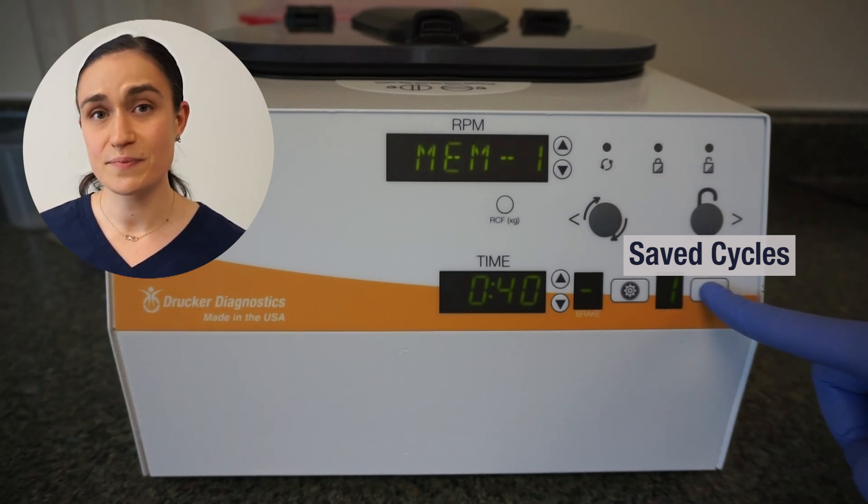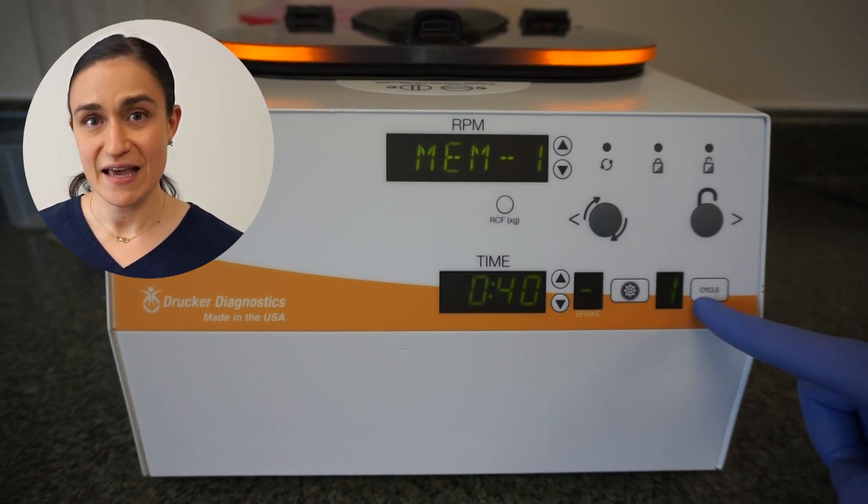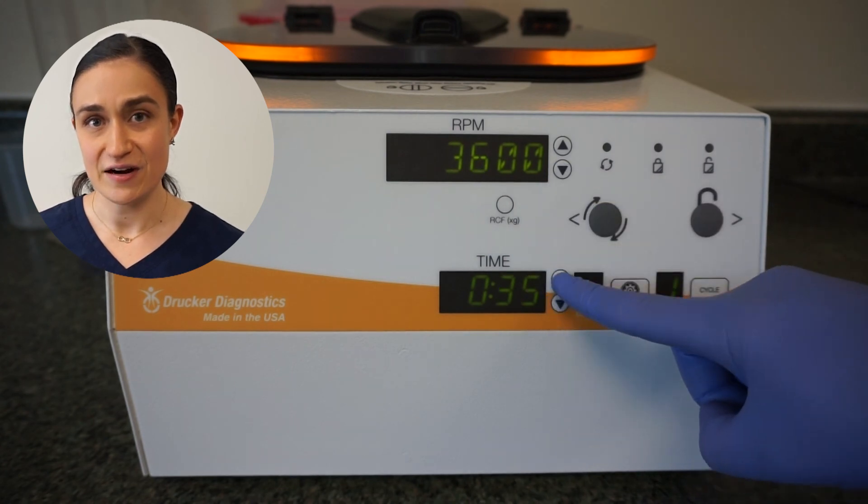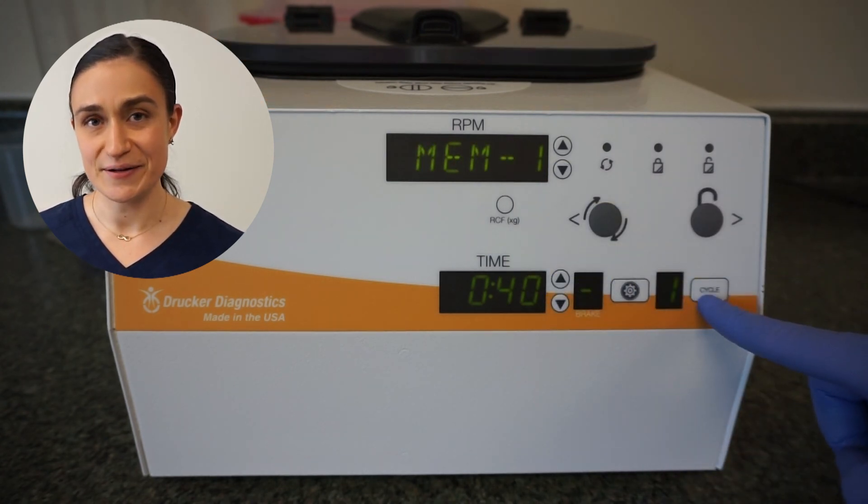You can also toggle between different saved cycles already stored in memory, or press and hold the cycle button to enter the basic menu, which will allow you to edit the RPM and time on a saved cycle. And those are the controls for your SARA-12 blood banking centrifuge.